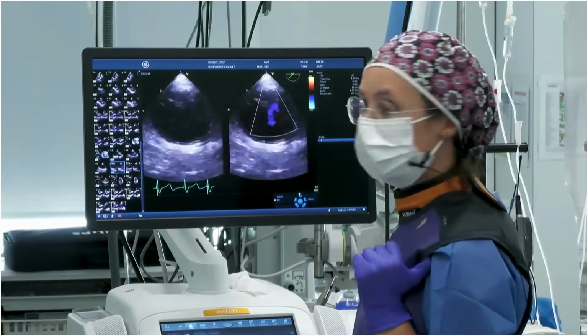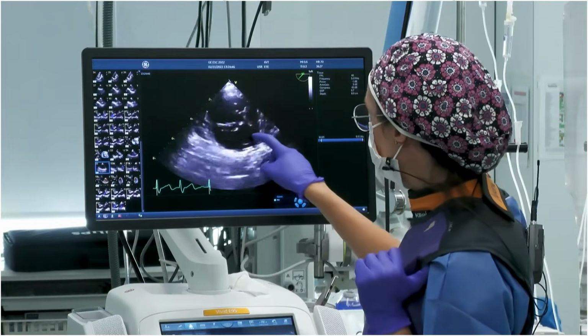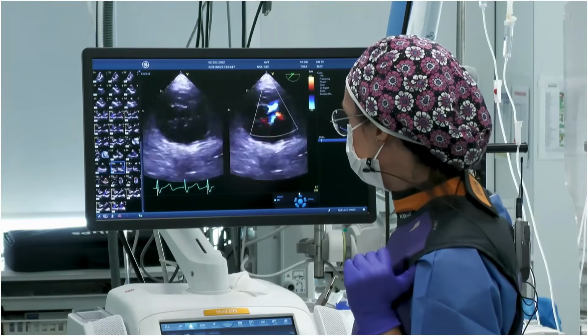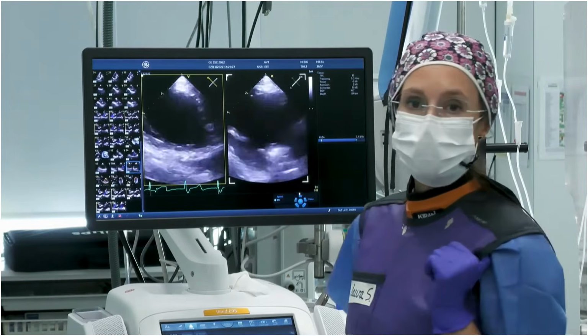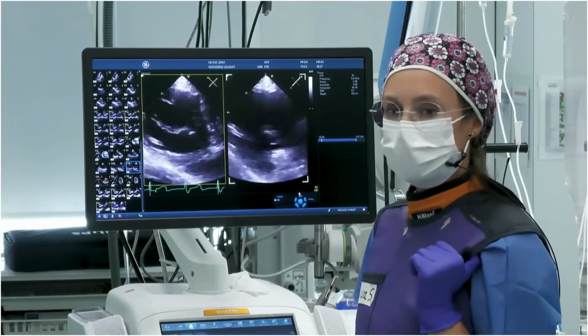I want to also show you more images of the patient. This is a direct 2D where we can see better this scallop in the anterior leaflet. And then an important thing is where to measure the gap of the tricuspid valve. We can do it in two places.